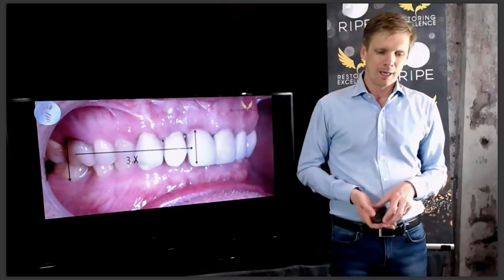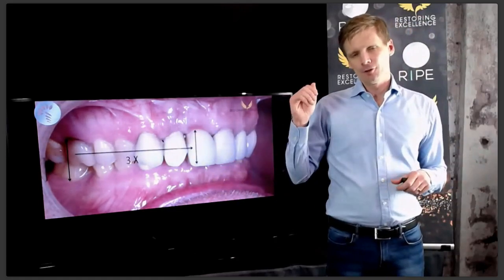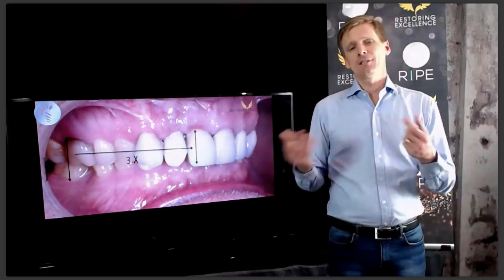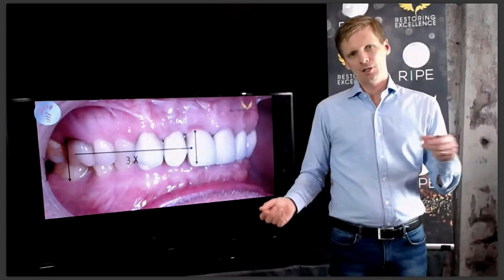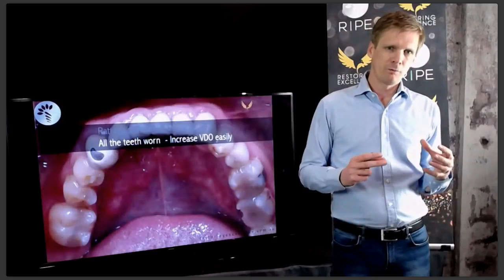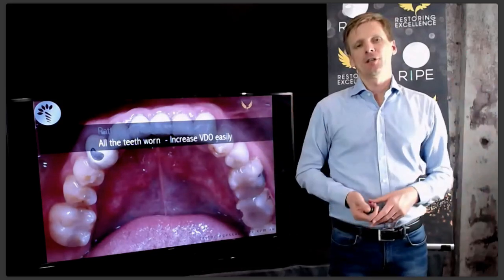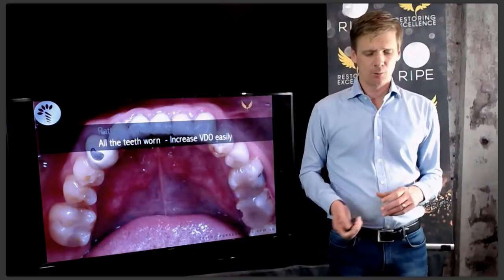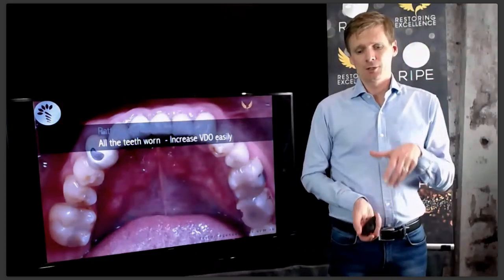central incisor. So now, when you have wear all the way across the arch from front to back, so wear everywhere, often the front teeth are worn much more than the back teeth, which works perfectly. You can then plan, you can take your impressions, you can take bite guard, face bows and everything, send it to the laboratory and go, just increase, and you can do the measurement from the front teeth or the back teeth. Now, so first type of patient, wear all the way from front to back, increasing the vertical dimension, very easy to plan or justify, and very easy for the patient to cope with, because they have usually lost vertical dimension, not just had compensatory eruption.